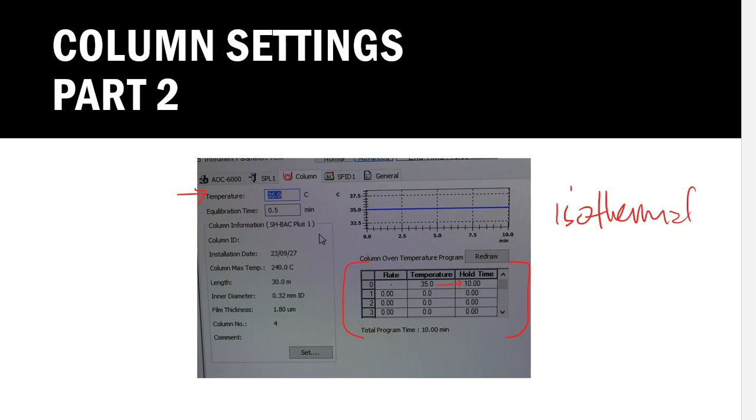But if I start making temperature changes and I say, okay, I want you to go to 65 and heat really slowly, and then I want you to go to 125 and get there really, really fast, I'm going to start keying in all of these temperature settings, right? And that's what the rate column and the temperature column mean. When I start changing all of that information, it recalculates how long this is going to take to run, and it will update itself.